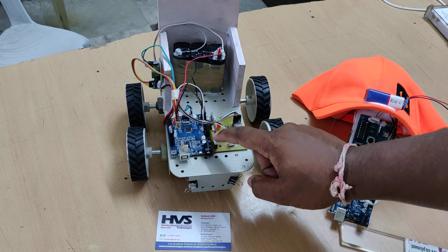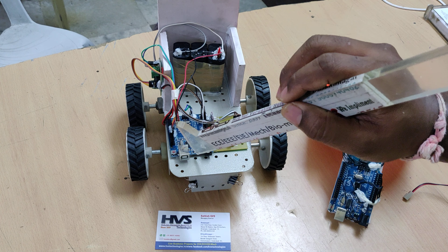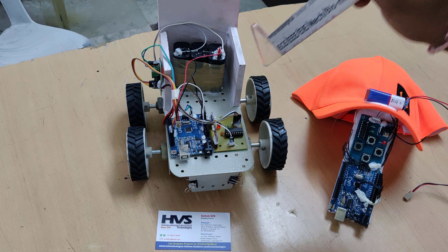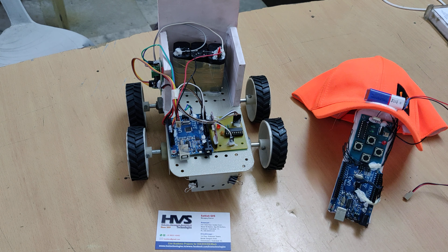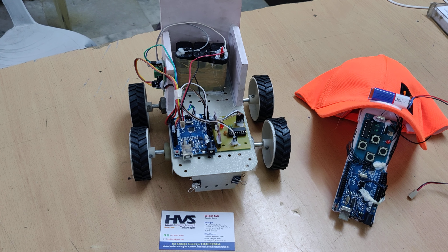Coming to the receiver section, this is the receiver along with the decoder, interfaced to the same Arduino UNO board. From here we control the two DC motors of the wheelchair with the help of the L293D motor driver.